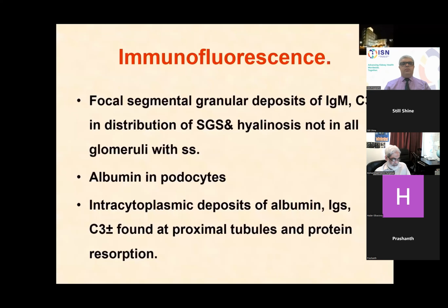Immunofluorescence. Also in focal segmental glomerulosclerosis, the immunofluorescence was not significant. A few cases may exhibit segmental granular deposits of IgM or C3 in the distribution of the sclerotic segment or hyalinosis.